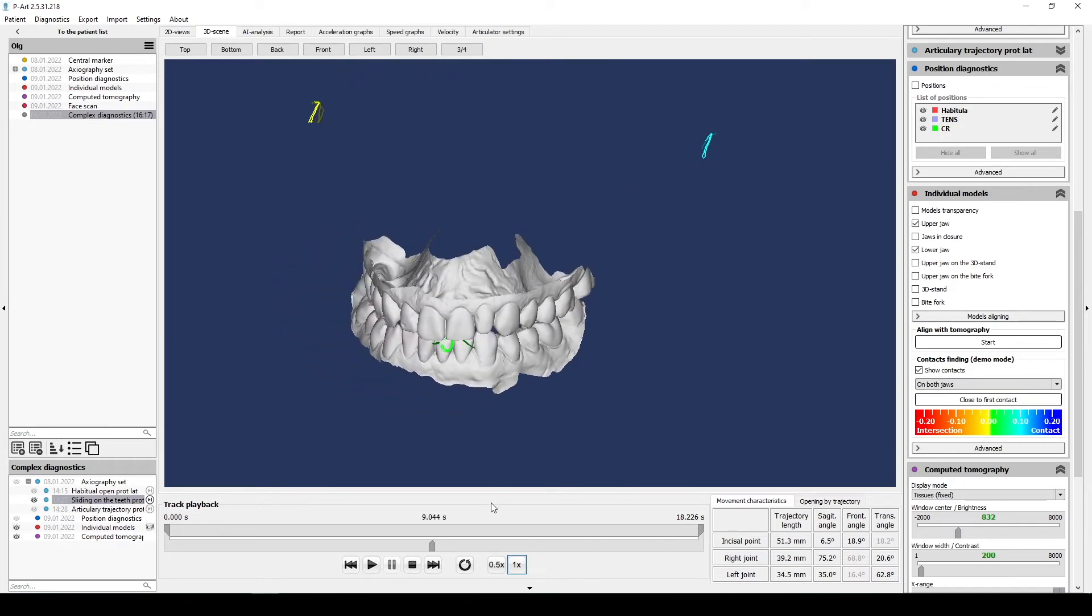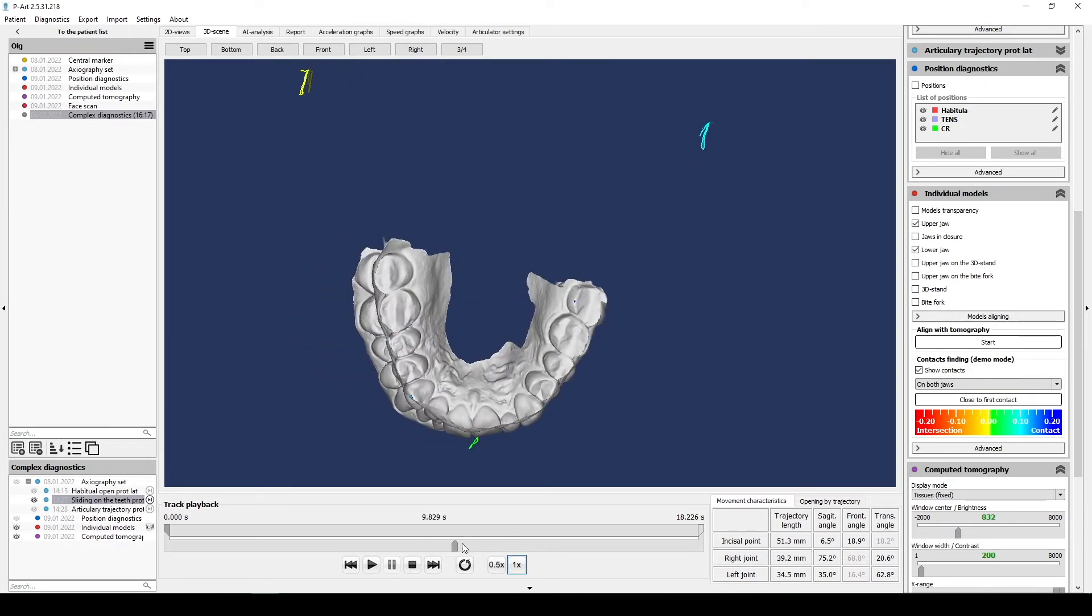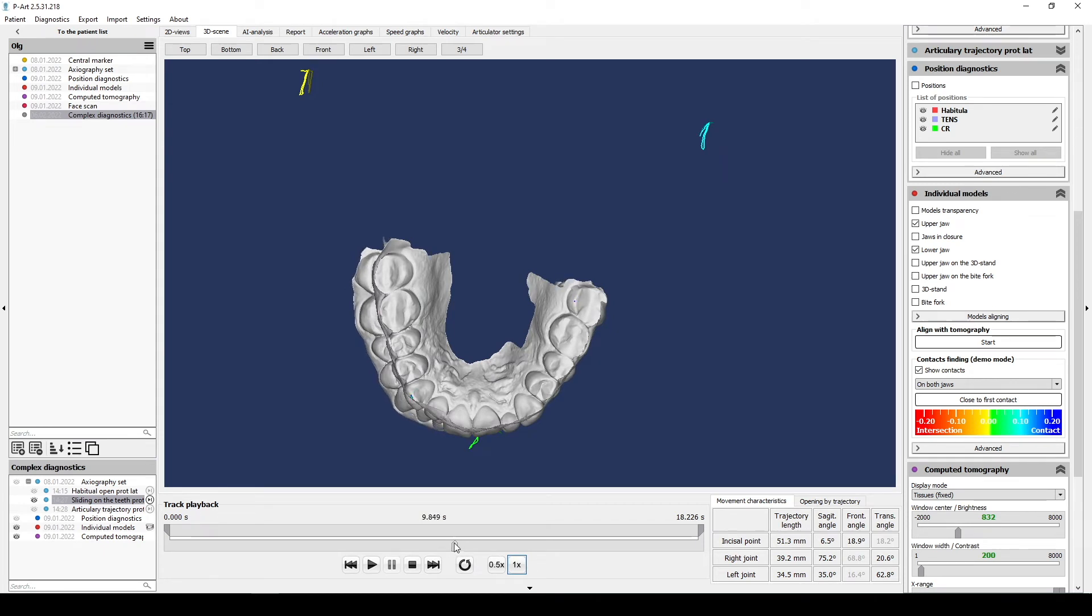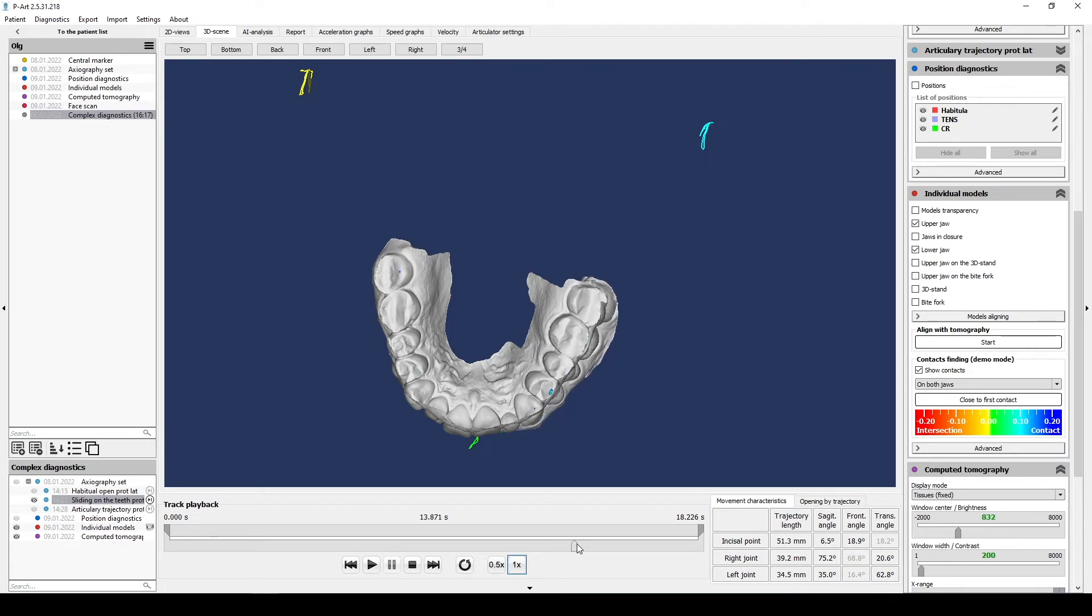It's very important because all super contacts and dynamic occlusal disorders force trajectories and can be the reason of TMJ disorder. That's why we analyze working side and balancing side with such trajectory, protrusion and lateral trusion with tooth guidance.